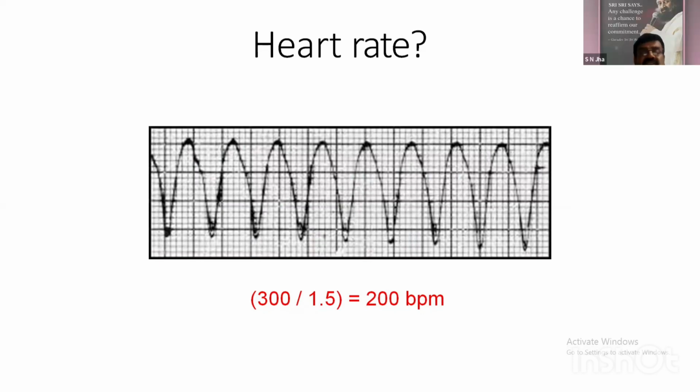So this patient is going to die. This is called ventricular tachycardia. If we do not intervene at this moment, this is not good. The heart is going to stop very soon. We need to give the patient something. What do we give? We generally give a DC shock.